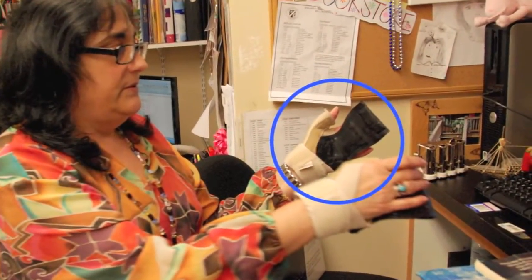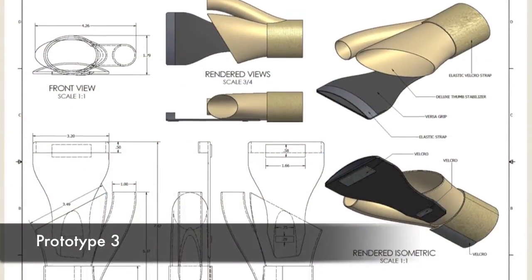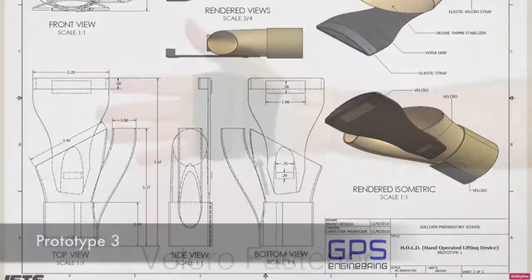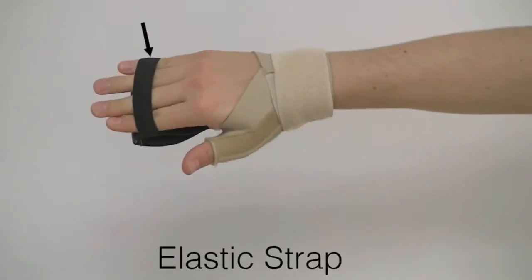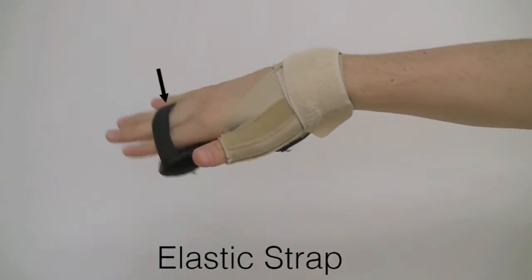When given to Lori, she enjoyed its smaller size and its ability to help her while lifting, but she disliked how the rubber grip flapped around and inhibited her ability to perform other tasks. Using this feedback, the team developed Prototype 3, which added a Velcro fastener that permitted the rubber grip to be folded away, and an elastic strap to secure the rubber grip to the fingers. This allowed the grip to be unobtrusive when not in use.